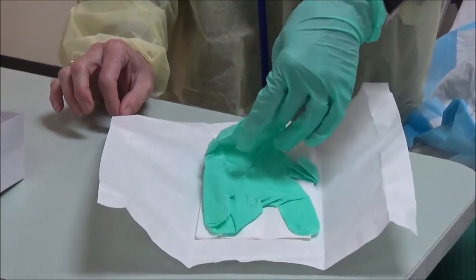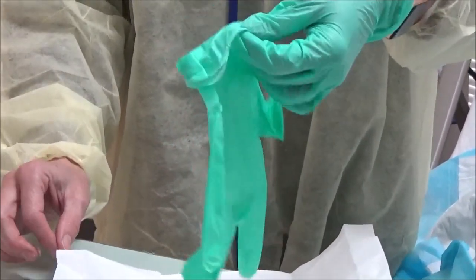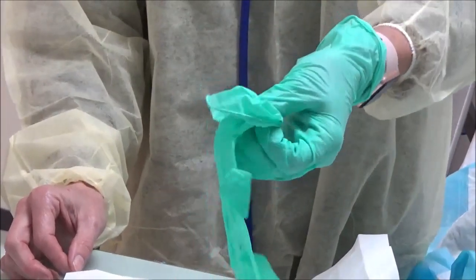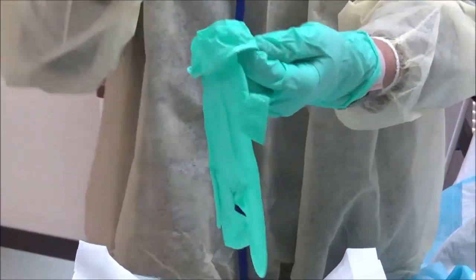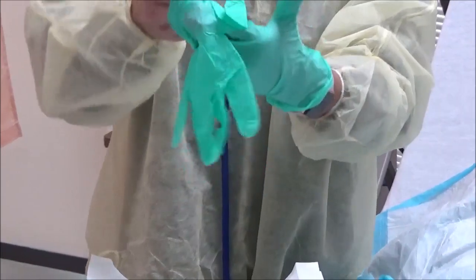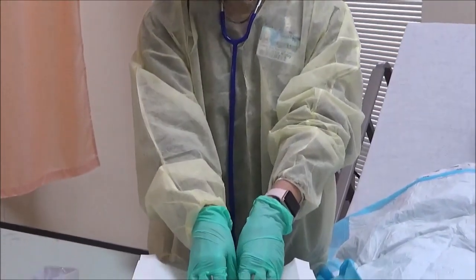So with the second glove, I'm going to grab up under the cuff part there and identify where my thumb is, which is right there. And y'all know how to put on sterile gloves. You've put them on since first semester, so this should not be a challenge for you. Protecting my other gloved hand and putting on my second sterile glove. Now, remember, this is sterile.